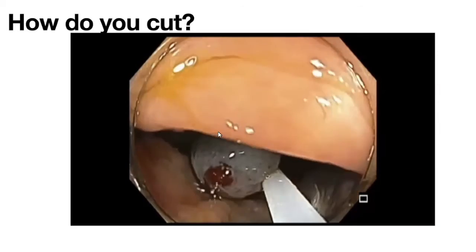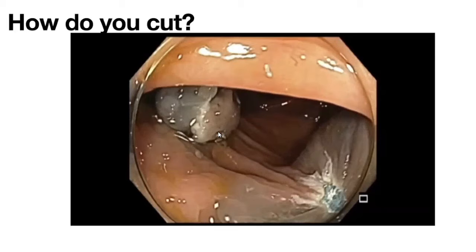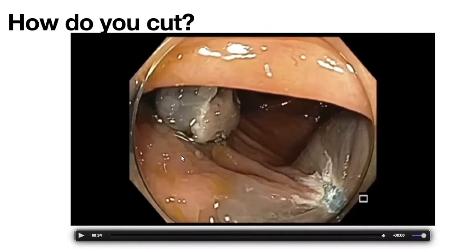And we use EndoCut Q, effect 3, duration 1, interval 1. And that's what we use for most of it. This is what I've learned during my trip to Japan. I visited Kobe at that time. I also had a chance to meet with Noria at that time.